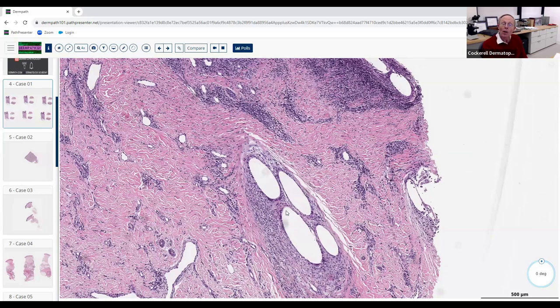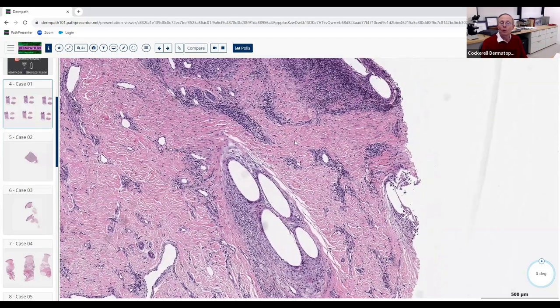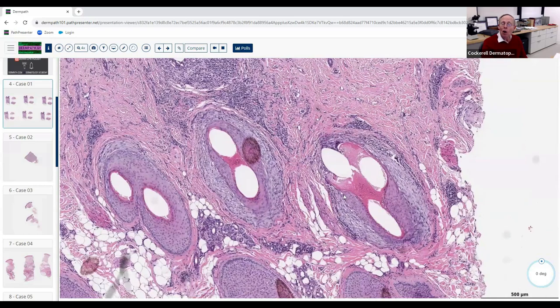When those stem cells are gone, the anagen-catagen-telogen cycle is finished — you're left with residual zones of scarring at the sites where follicles used to be. This is a beautiful example of lichen planopilaris. There are two other alopecias that target the follicle directly like this: frontal fibrosing alopecia — which histologically looks virtually identical to LPP — and central centrifugal alopecia (follicular degeneration syndrome), occurring most commonly in African-American patients who use various scalp products.